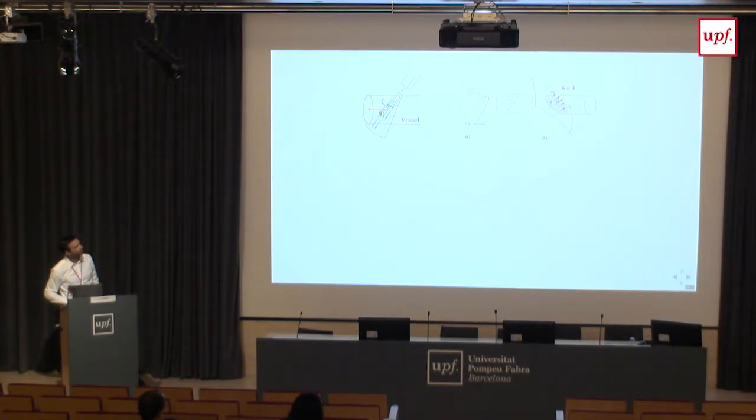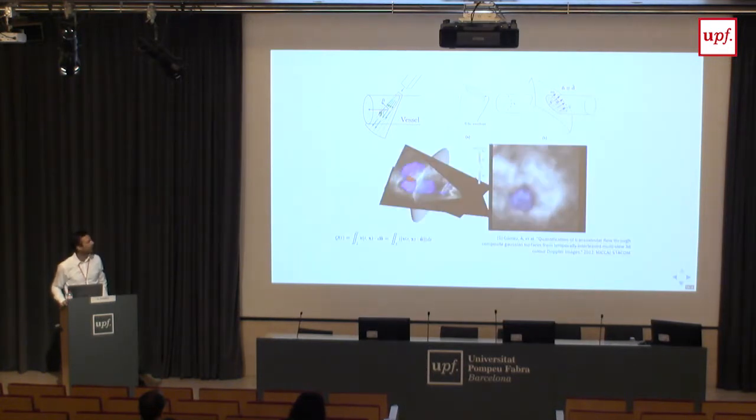So you can use this sphere to calculate flow, and then you have the component of the velocity that is parallel to the perpendicular vector of the surface, and you can do angle-independent flow quantification. So this is some work we did in the past using this technique. Placing a spherical cap, this is what a color Doppler image in 3D looks like. And this can give you some accurate results.